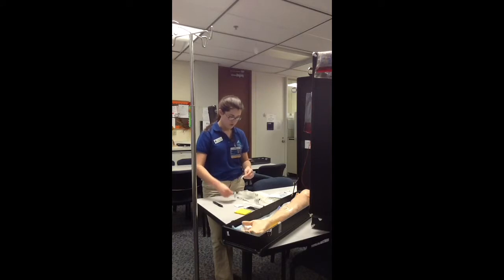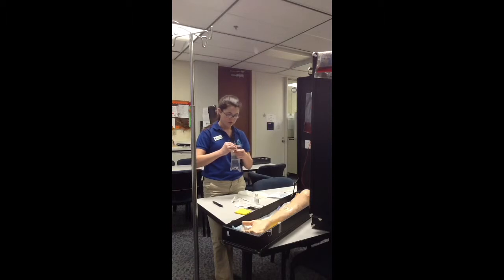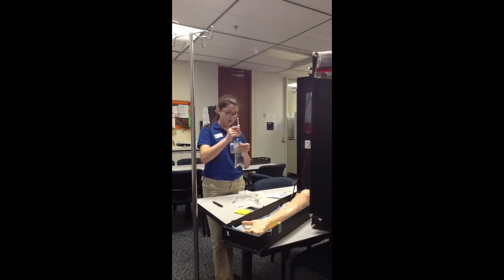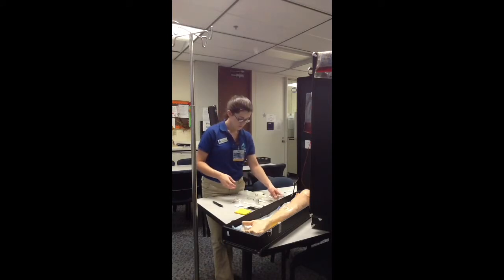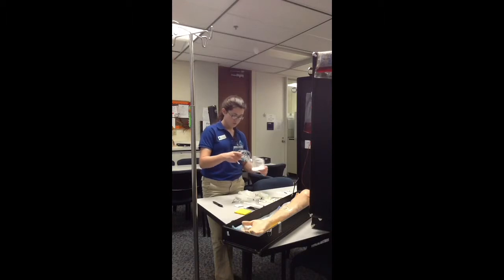And I'm going to take my saline bag and just clean this port. And now I'm going to inject the medication. And this goes into the sharps. Now I'm going to gently rotate my medication bag to mix the medication. And now I'm going to attach my tubing.